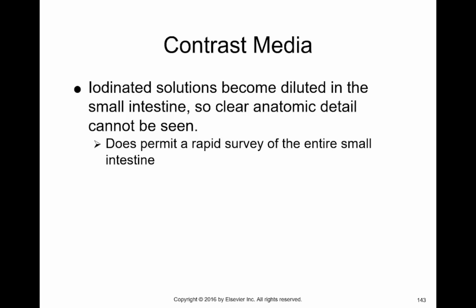If you're doing double contrast, you cannot do that with iodinated contrast. Also, if the patient is allergic to iodine, that's a very important thing for you to ask the patient. If they have medication allergies, you need to know that before you give the patient iodinated contrast.